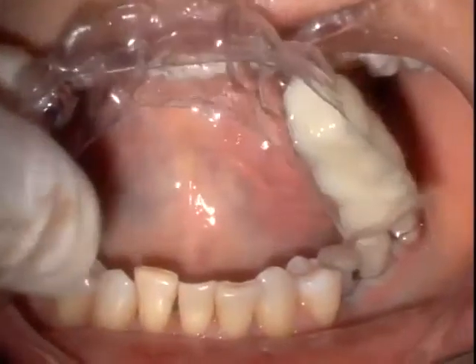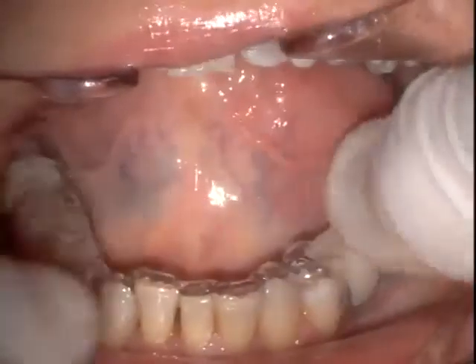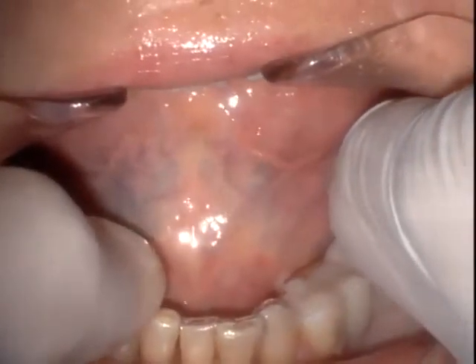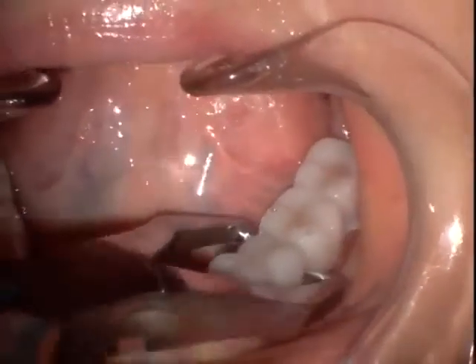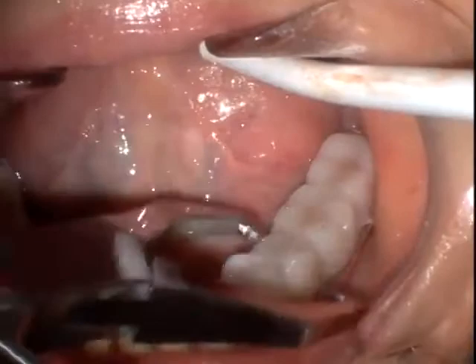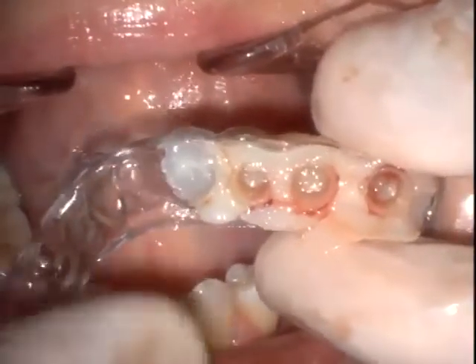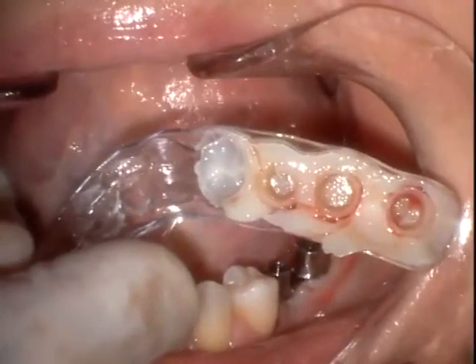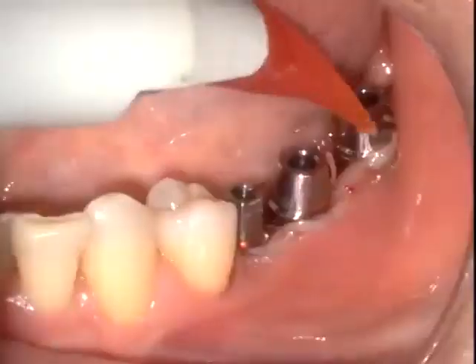Or if the implants are very stable, as they were here, very good, very high Hounsfield units and good initial torque insertion above 40 Newton centimeters, we simply put acrylic copings that were fabricated chairside on the abutment analogs, and then utilized the restorative guide filled with triad material. And after approximately 3 minutes, we then remove this vacuform matrix and it picks up the acrylic copings. And now we have an immediate, fixed, splinted, temporary restoration.